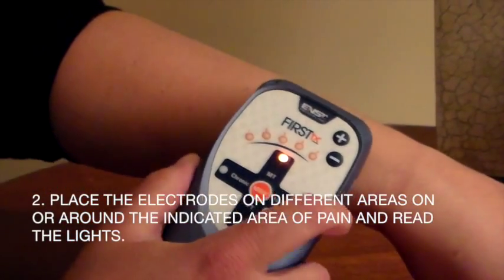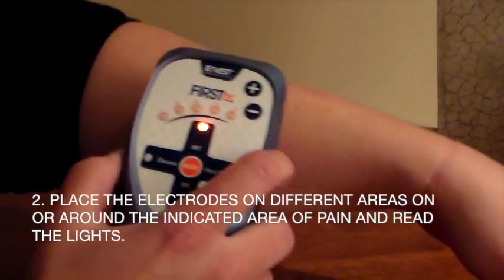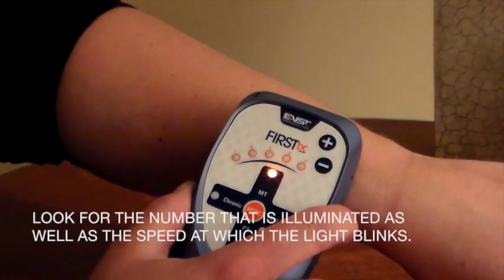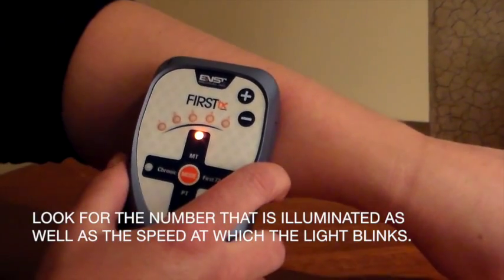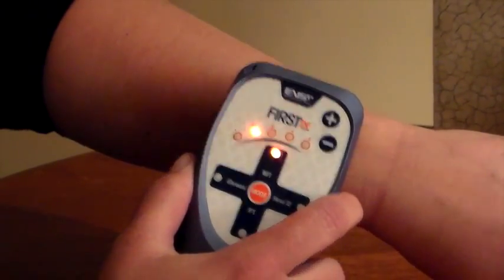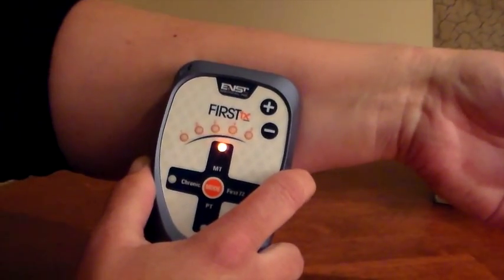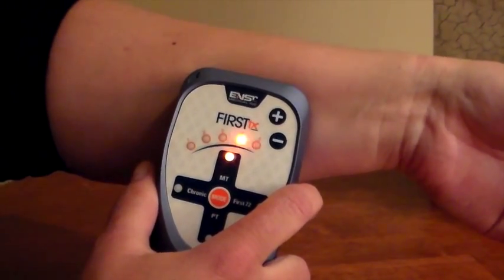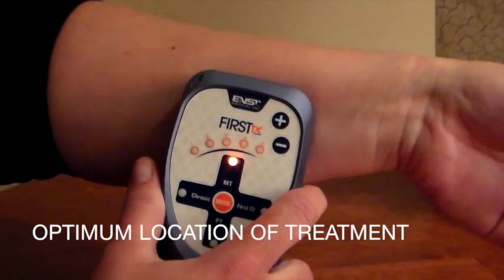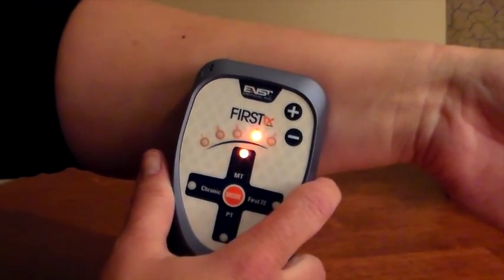The second way to determine an optimal location for treatment is to place the electrode on different areas on or around the indicated area of pain and read the lights. You're looking for the number that is illuminated, one through five, as well as the speed at which the light blinks. So there's a two that is lit and blinking quickly, a three that is more slowly blinking, and a faster blinking three. Out of those spots, a fast blinking four is the optimum location for treatment. In MT mode, you're going to hold the electrode firmly on the skin in that spot and treat it.